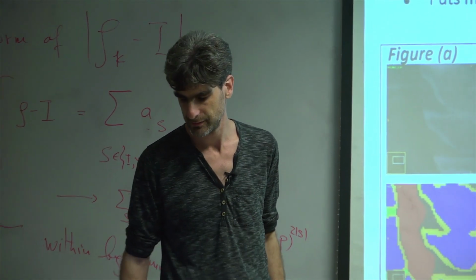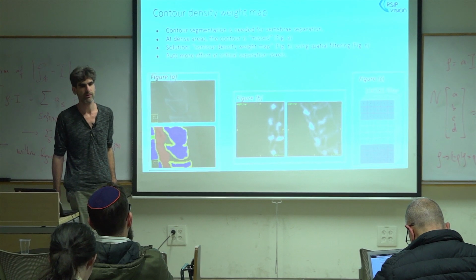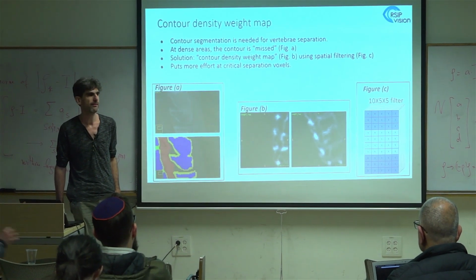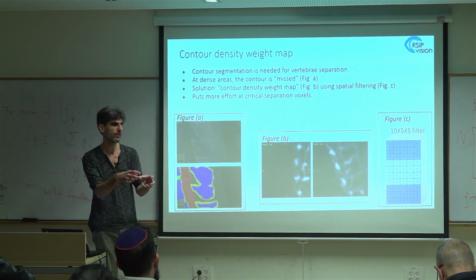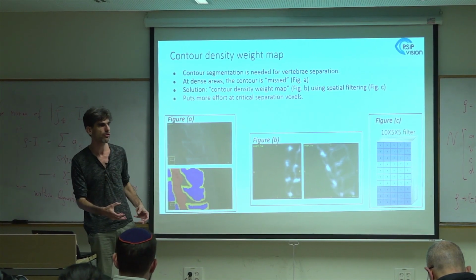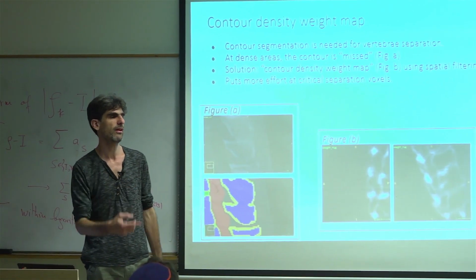Yeah. Well, the problem of explainability is pretty common in deep learning. It's always a problem with deep learning. But this is more of a user interface type of question. It's also a question of what you're going to show them. Are you going to show them only this segmentation? Typically, no. You show them the CT scan, but you tweak it, you emphasize certain things, you can show an overlay of the segmentation, you do an additional validation.